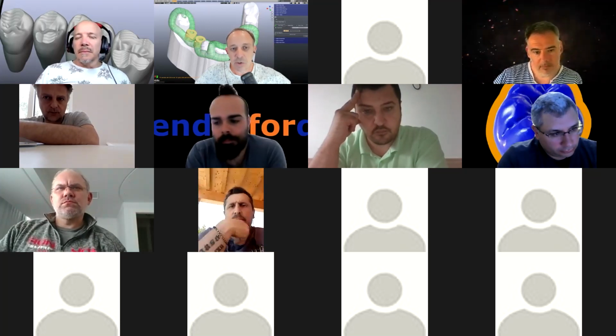So, when do you think that the model will be available at the site? Yeah, so we've got 6 stages of beta testing. Stage 1 is probably going to come to an end in the next 2 or 3 days. That is just making the simple crown and then using the articulator with the crown that Michael was going on about at the very end of it. Then we've got making copings, which will follow this one, and then a couple of other steps: inlays, onlays, and veneers. So we were hoping, I think we're a bit optimistic, with 2 weeks of beta testing, might be 3 weeks of beta testing. Yeah. And then the tutorials are being made currently. So hopefully within the month, we'll be able to release the module, which will be good.